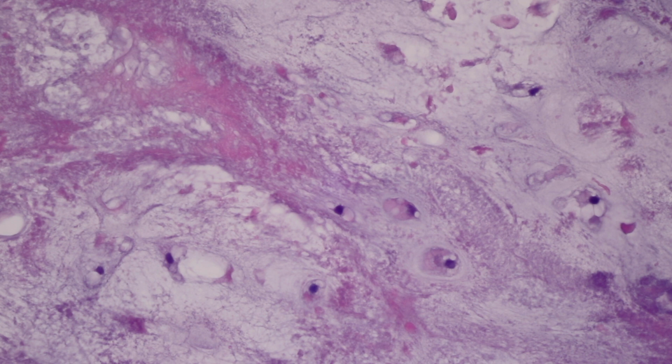I want to see evidence of infiltration in cartilage tumors that are relatively hypocellular and are showing mild cytologic atypia. What's moderate cytologic atypia in cartilage tumors? You could imagine a nucleus 2 to 3 times the size of a normal chondrocyte nucleus. Instead of being nice and round or oval, it will frequently have an irregular contour, becomes more elongate, and now reverts to being hyperchromatic. So it's an enlarged, irregular, hyperchromatic nucleus. When you see that type of nuclear change, that usually in a true chondrosarcoma will be accompanied by hypercellularity and infiltration.